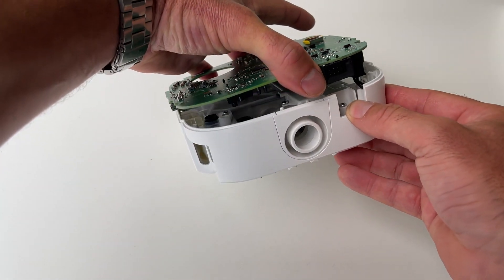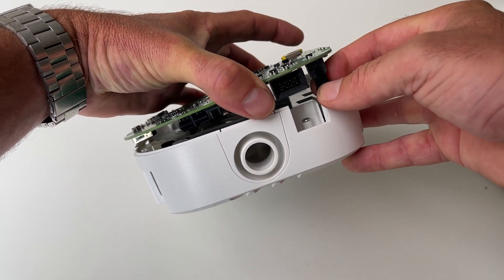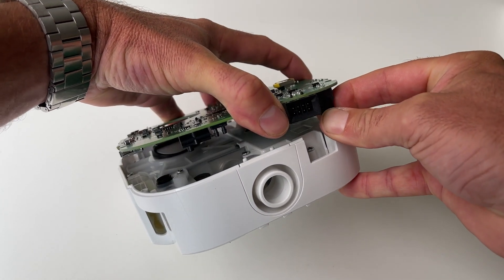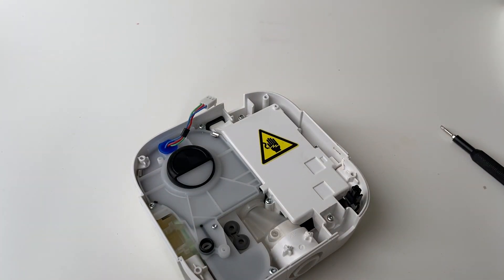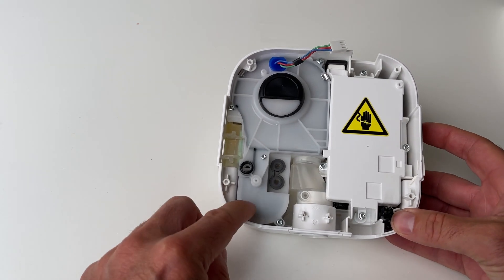Lift it up here and you'll see this one on the side — it's just got a little clip. You just sort of push your thumb in at the bottom here and then give it a little wiggle and it'll just unclip. There you go — there's your little circuit board. Just put that to the side as well.